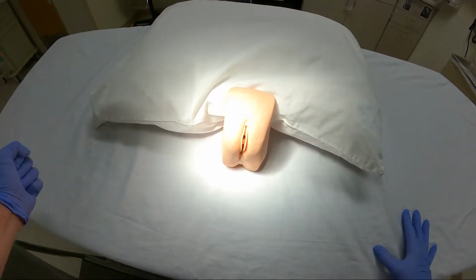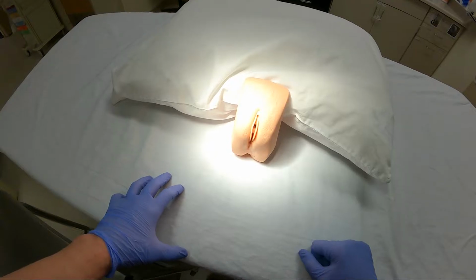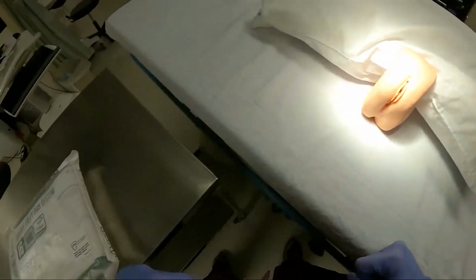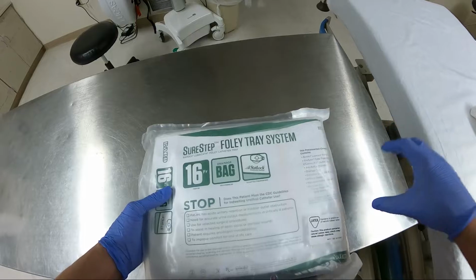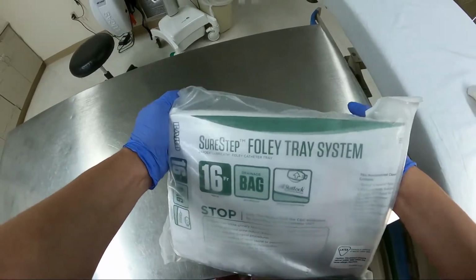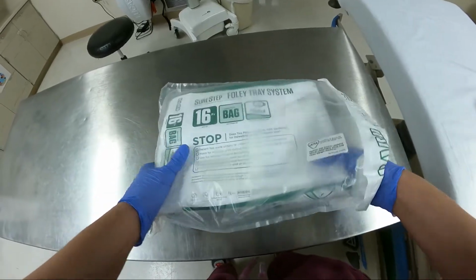So you would get a washcloth or one of our bath packs and clean them up, paying special attention to make sure that your entire area is clean. Once that is done, then we're going to open up our catheter. You need to have a surface that is adequate for the task at hand. Open it up. Now remember, this is sterile.